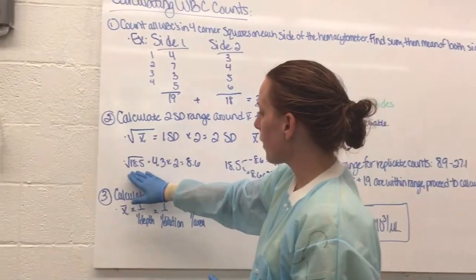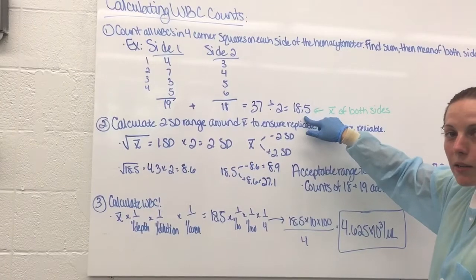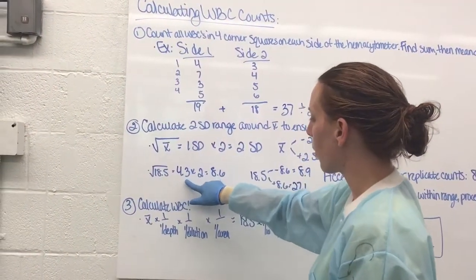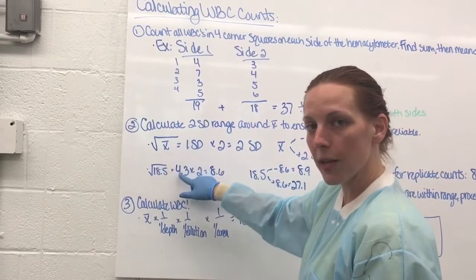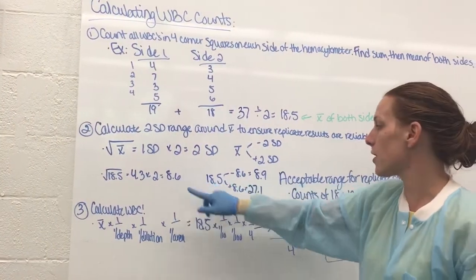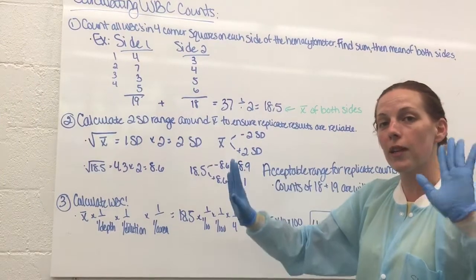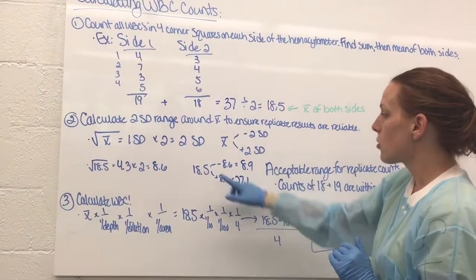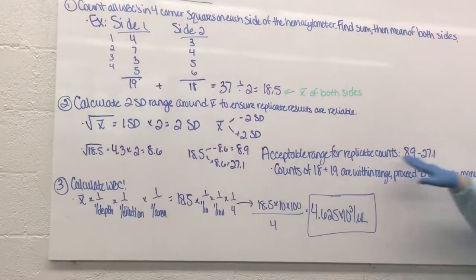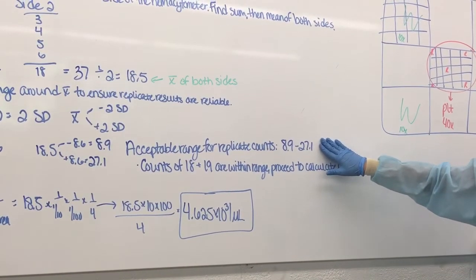So in our example here, we're going to take the square root of 18.5, which remember was the mean of side 1 and side 2. We're going to do the square root, that's 4.3, that's 1 standard deviation. Multiply it by 2, 8.6 is 2 standard deviations. So we need to take our mean and figure out 2 standard deviations above that and below it. So we're going to subtract 8.6 and add 8.6. So the acceptable range for our replicate counts is 8.9 to 27.1.